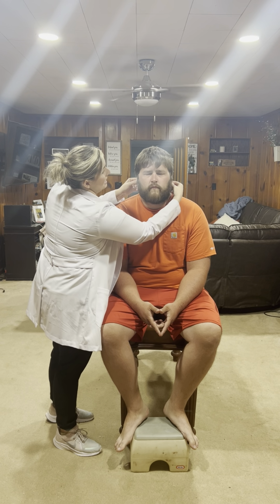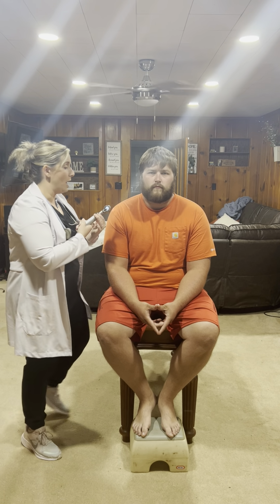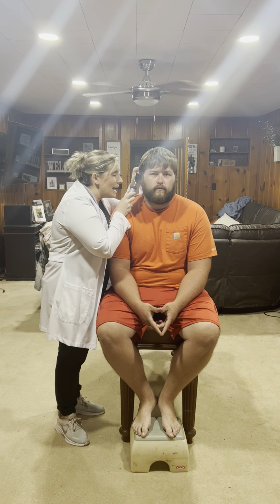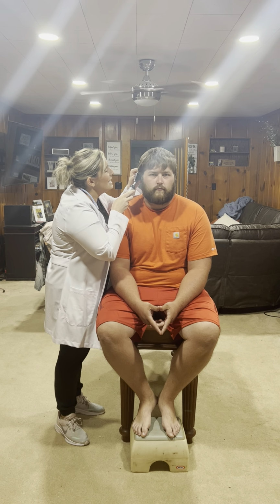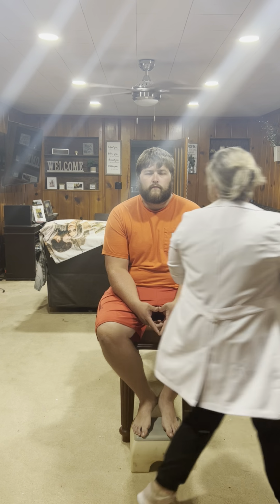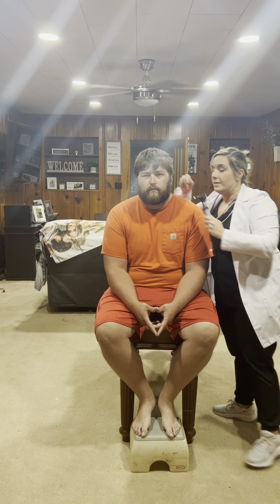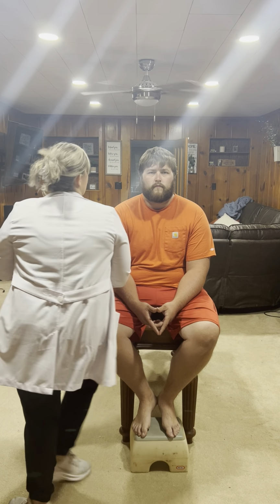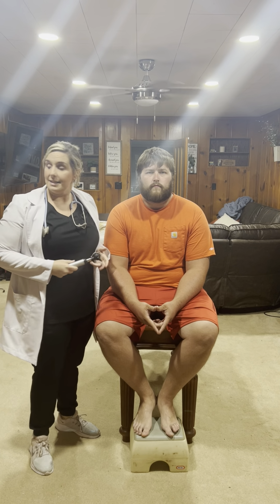We're palpating the pinna and the tragus for tenderness and masses. I'm going to inspect with my otoscope the tympanic membrane and auditory canal. We're looking for that the auditory canal is patent and that the tympanic membrane is pearly gray. I'm looking on both sides for that. Then we will test the vestibulocochlear nerve, which is cranial nerve number 8, by doing a series of hearing tests.